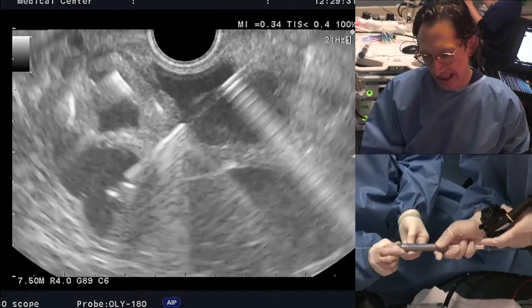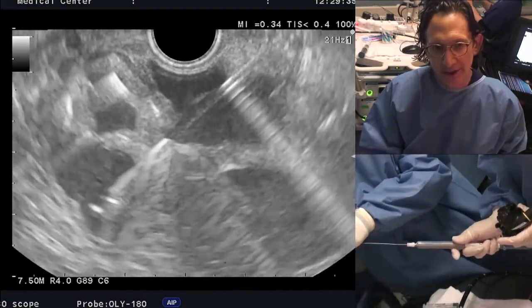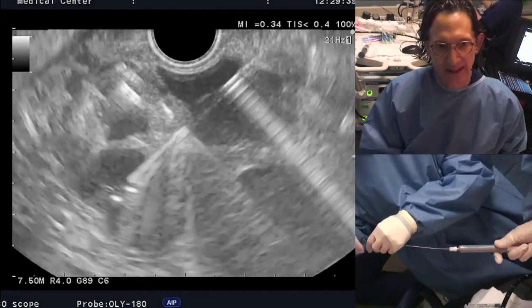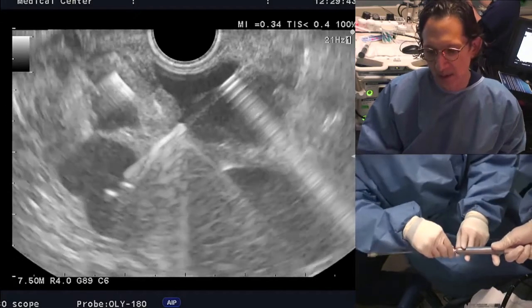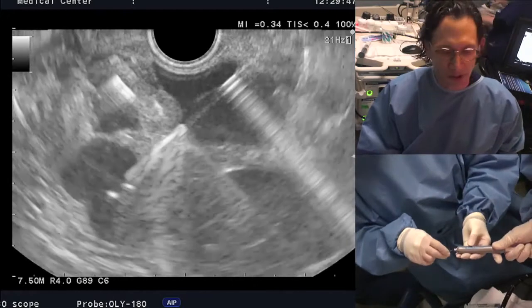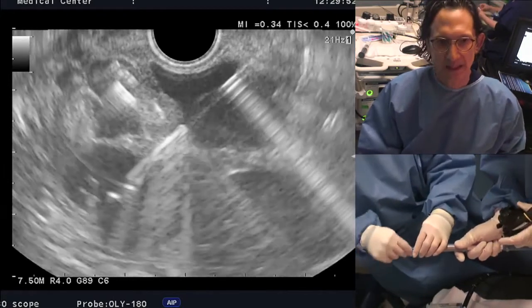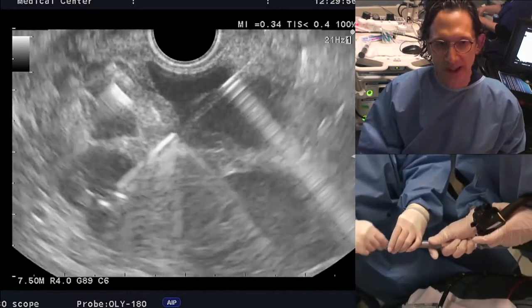And now we are attaching, luer locking our introducer. That introducer comes with a kit, so this is nothing that special. Comes in the kit that the radiologists use. And we have introduced the coil now into the FNA needle. No need for the introducer. Now we are advancing the stylet. And we'll, once again, wait for the coil to come out.